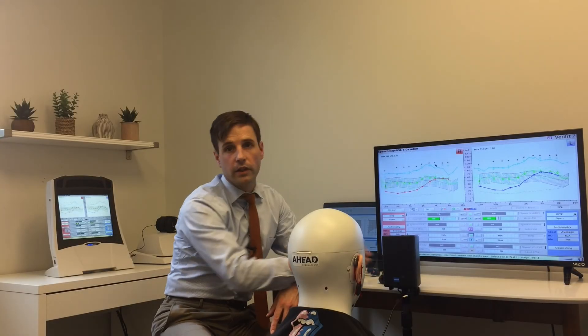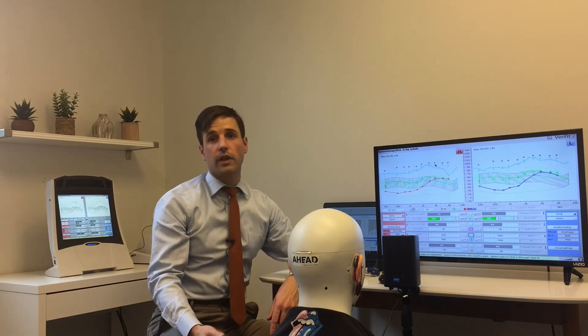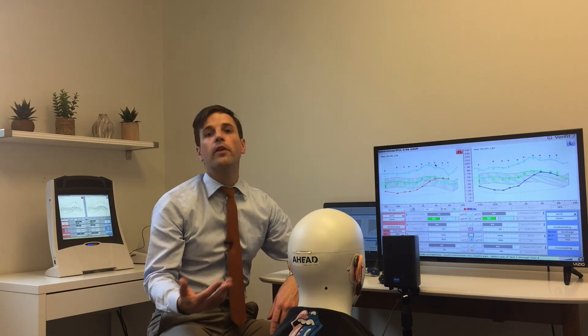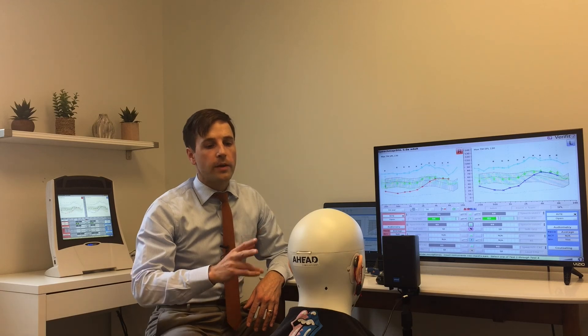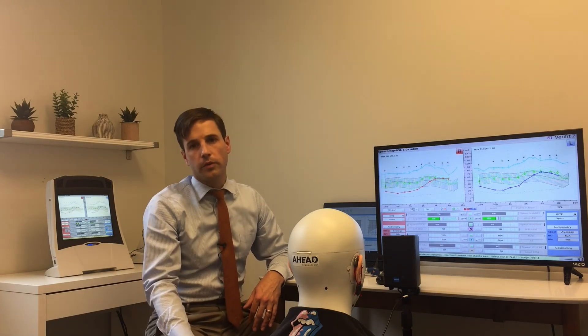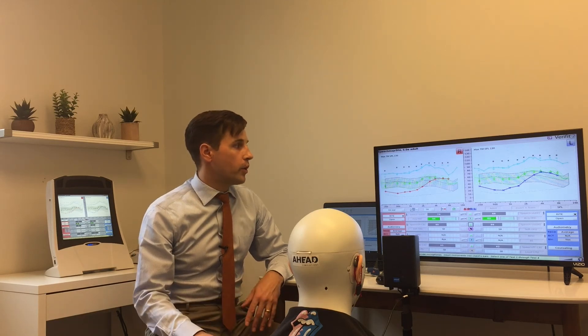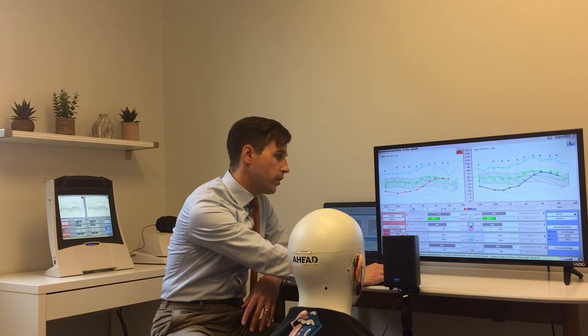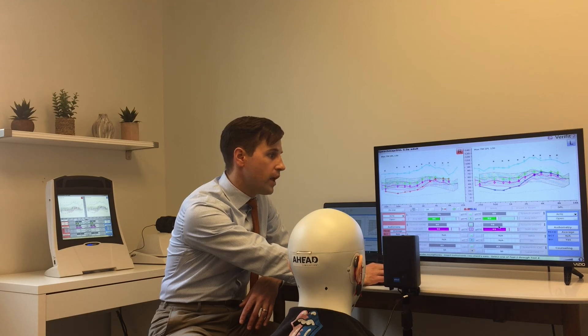These are DSL predicted loudness discomfort levels, and you can measure them — it's a good idea, just as running an RECD on everyone is always better than predicted. But again, you don't want that to be a barrier; we have predicted values for a reason and they're typically reasonably close. What I'll often do is put on a different passage as a gauge for the patient to see if at that soft level they can actually follow it, and I'm looking at our targets to make sure we're not way under for soft speech or way over. This is looking pretty good; we can look at the difference between unaided and aided for soft speech as well, and we're seeing about a nine-point boost on the left side.